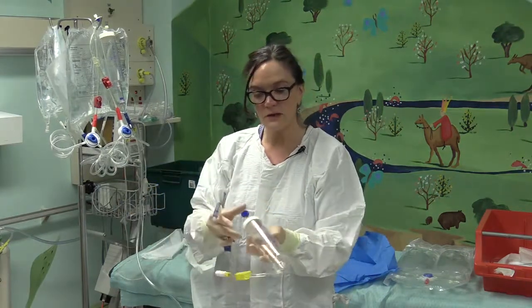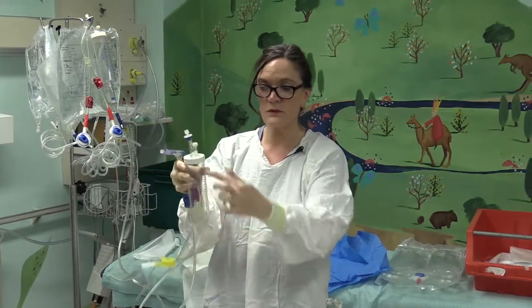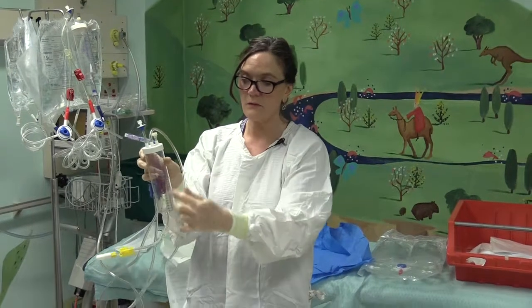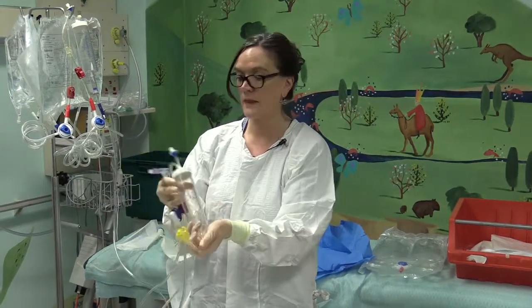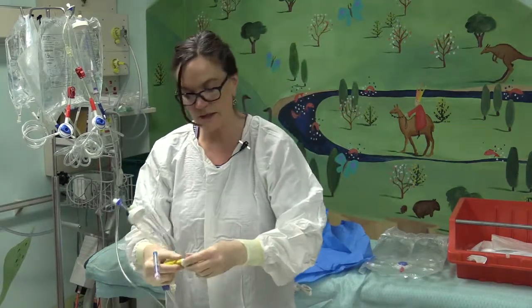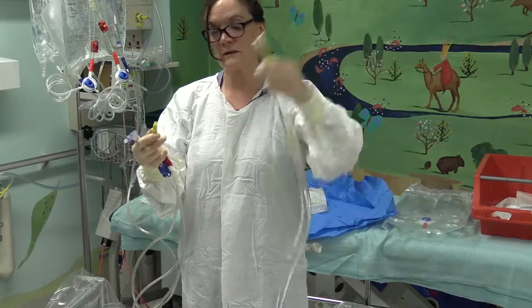So I'm now going to connect my drainage cylinder, which is also measured up to 240 mils. I'm going to connect it to the large drain bags.